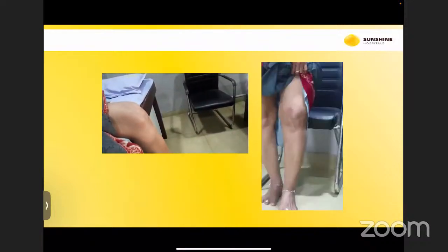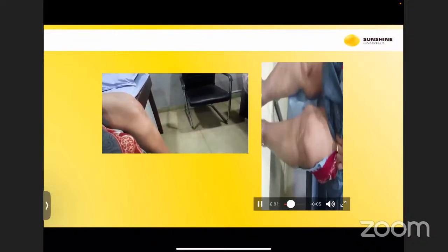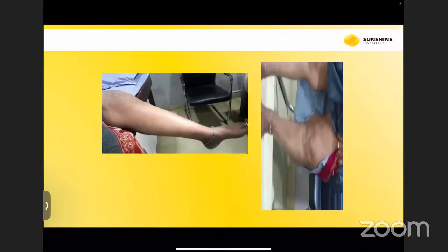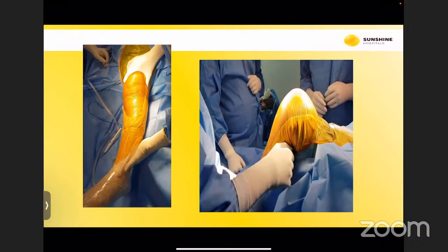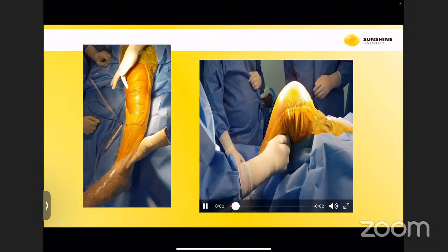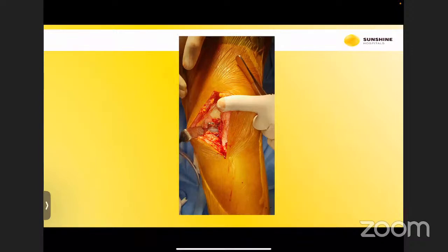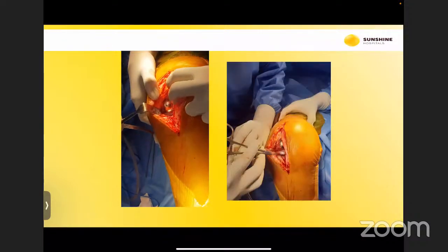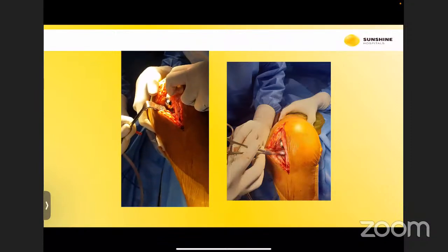So you see, it looks normal over here. But she has a bit of a varus thrust, you can see there. It doesn't look too bad in the sagittal view. So we opened it up, and we were very surprised to find that the poly had reduced, but it is back to front. So it somehow auto-reduced itself. But definitely we can't leave it like that. So we went through the range of motion to see what's going on. We distracted and pulled out the poly.